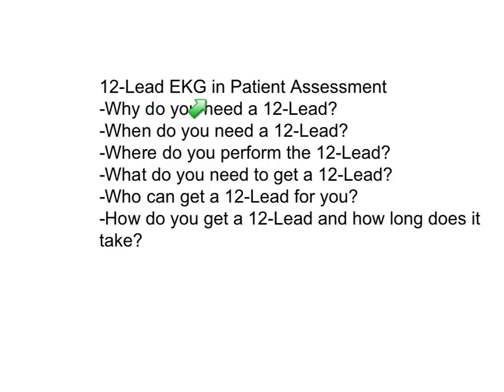So why we need one? Again, high definition and then more views. The limb leads give you 3 or 4 views. The 12-lead is going to give you 12 views of what's going on in the heart.